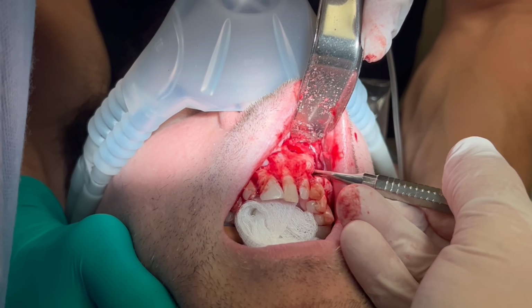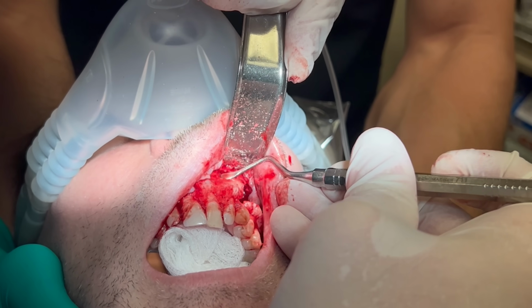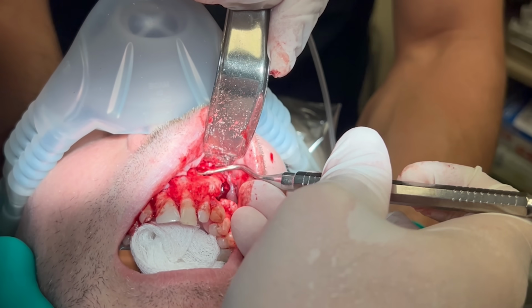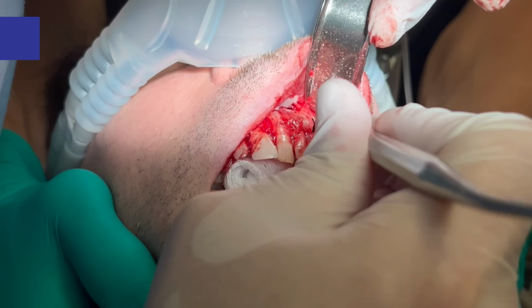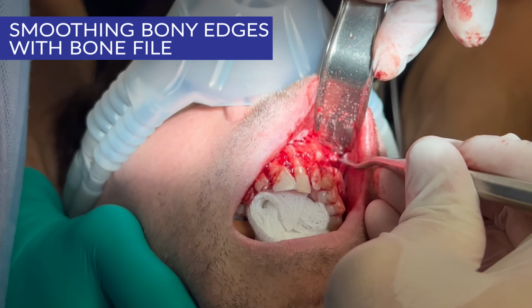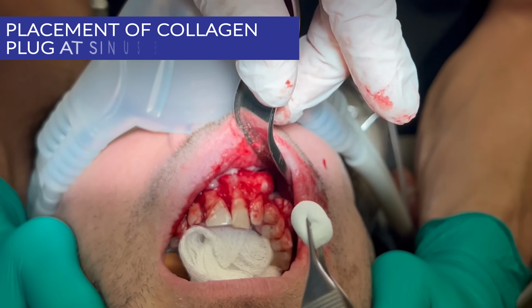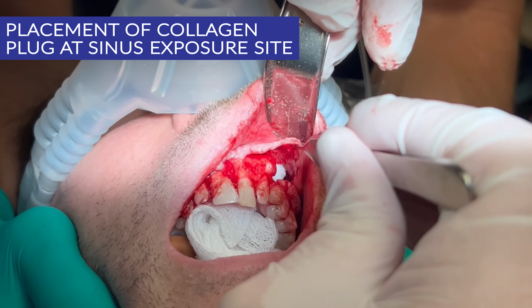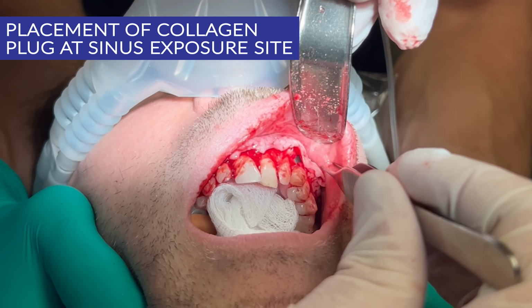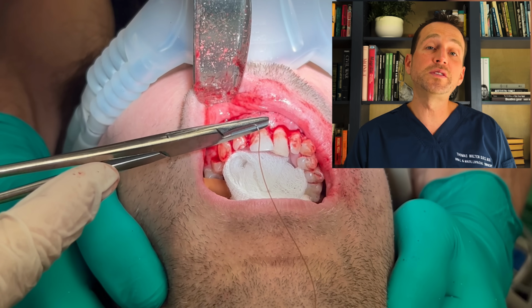I continue to curette and scrape the bony walls until I'm confident I have everything. Now I rinse and confirm I'm looking at nothing but healthy bone. Finally, I close the site primarily.